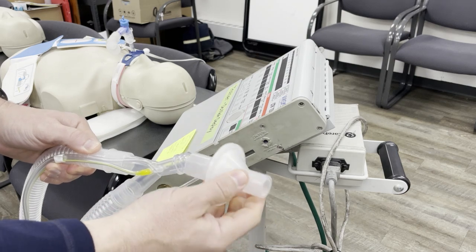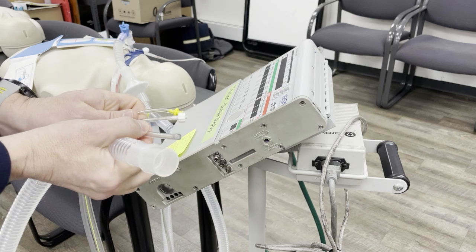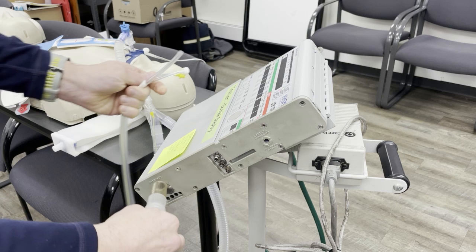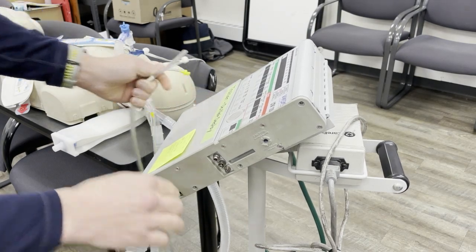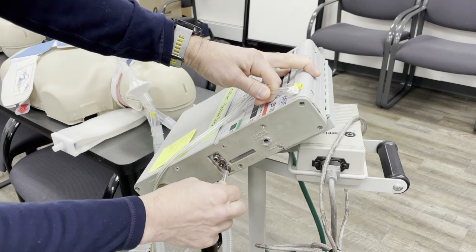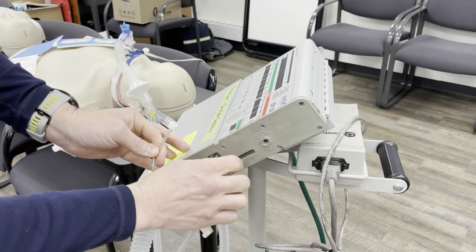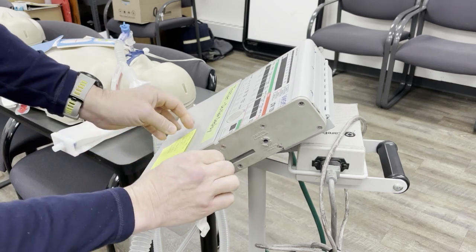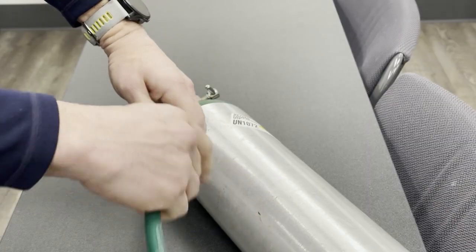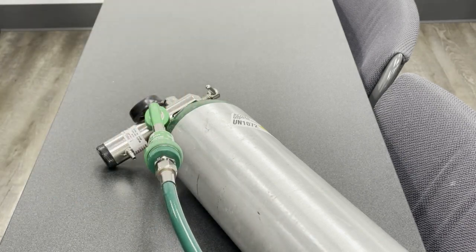First steps: attach the vent circuit and HEPA filter. Connect to your oxygen tank via the quick connect, and make sure the valve is open.